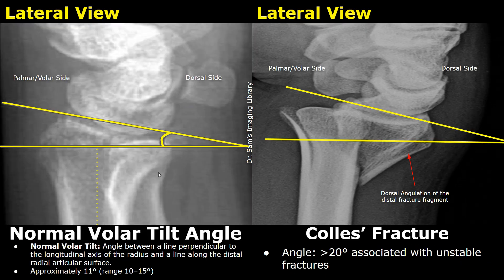The volar tilt angle is measured in a lateral view. It is the angle between a line perpendicular to the long axis of the radius and a line along the distal radio articular surface. Normally this angle is between 10 and 15 degrees. In an unstable Collis fracture this angle can be greater than 20 degrees.